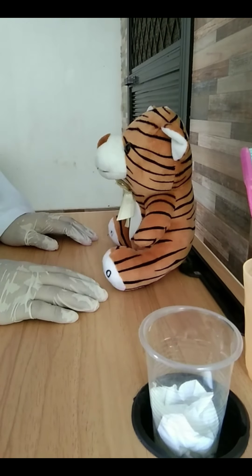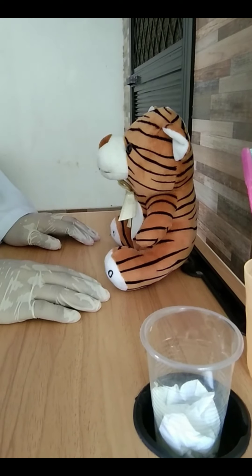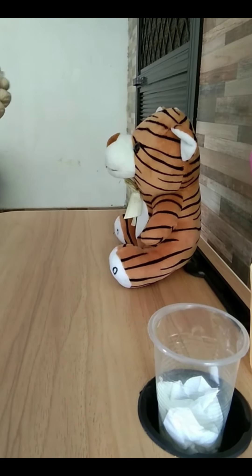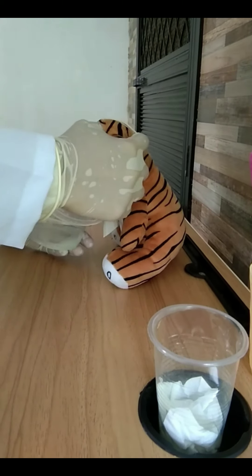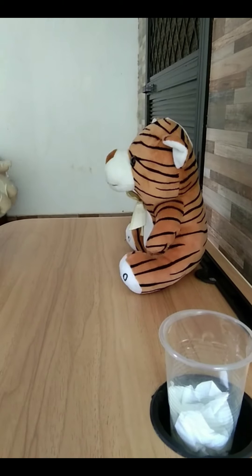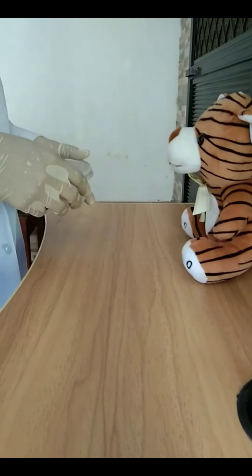Then expect the client to expectorate directly into the specimen container without touching the sterile inner surface of the specimen cup. Have the client repeat the coughing process until 5 to 10 ml of sputum have been collected.